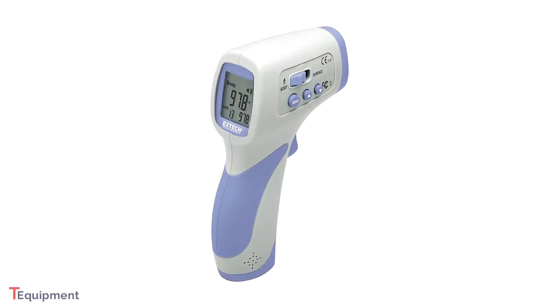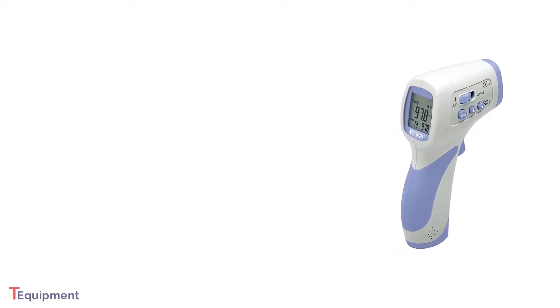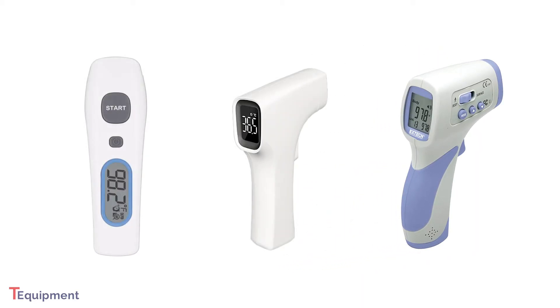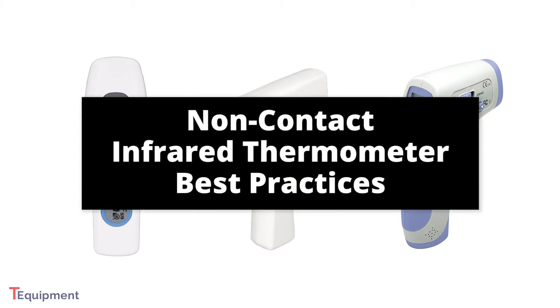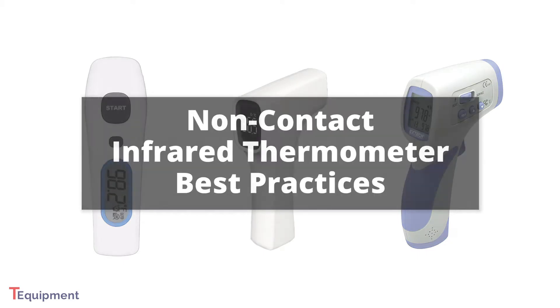A non-contact infrared thermometer is an affordable and effective tool for measuring a person's temperature from a distance. In this video, we'll go over some best practices for using these tools, which will help you get the best results.